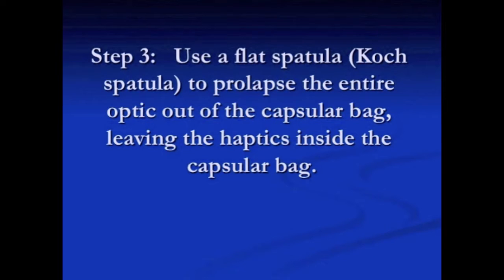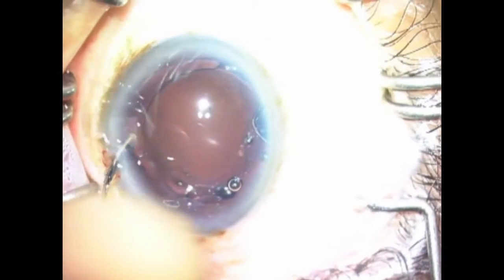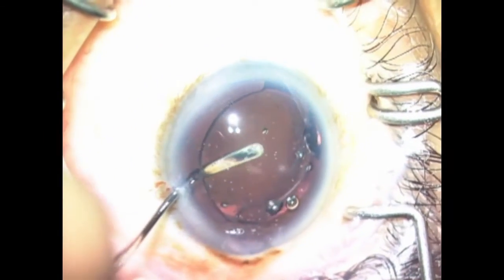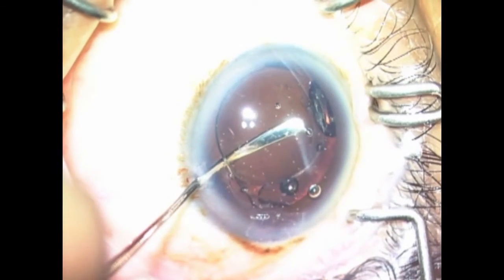Step 3. Use a flat spatula, such as a Koch spatula, to prolapse the entire optic out of the capsular bag, leaving the haptics inside the capsular bag.